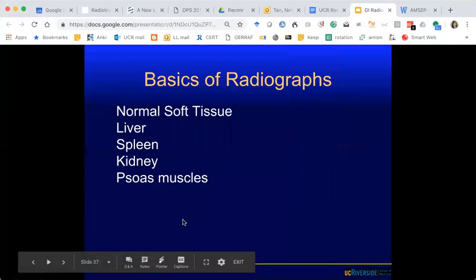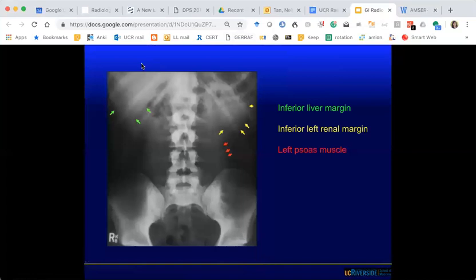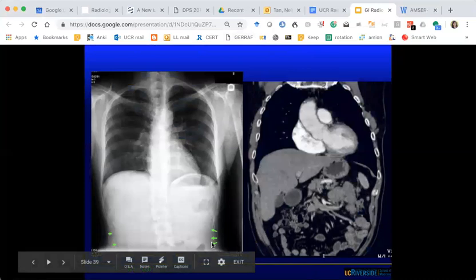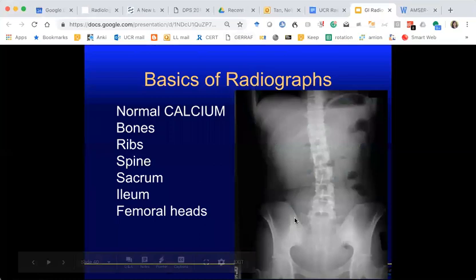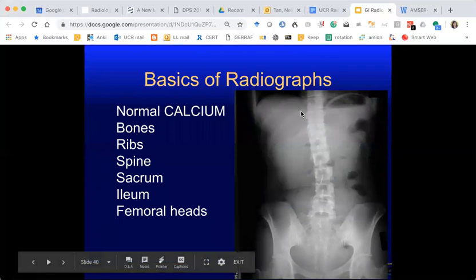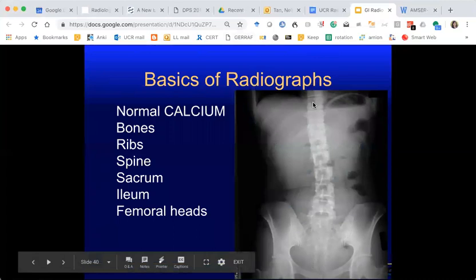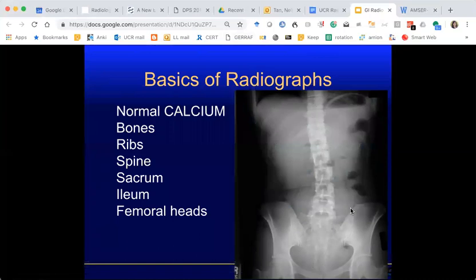Other things to look for are the normal shadows of solid organs. In the right upper quadrant, the only thing that should be there is the normal liver shadow. Here is the shadow of the kidney, sometimes the spleen shadow, and this triangular shadow is the psoas muscle. There is normal preperitoneal fat — fat is lucent, not as lucent as air, but lucent. Be mindful there are normal lucencies that are actually normal soft tissues. You can also look for bones — patients can have metastases, so including bones in your search pattern ensures you don't miss mets or subacute fractures.